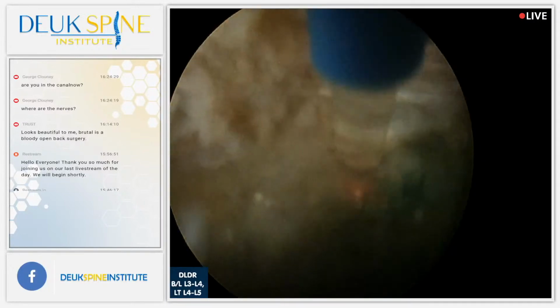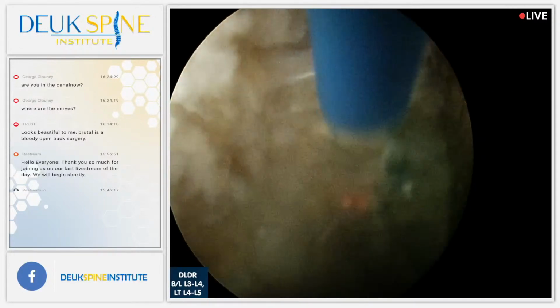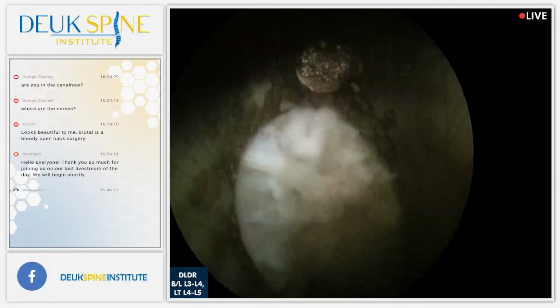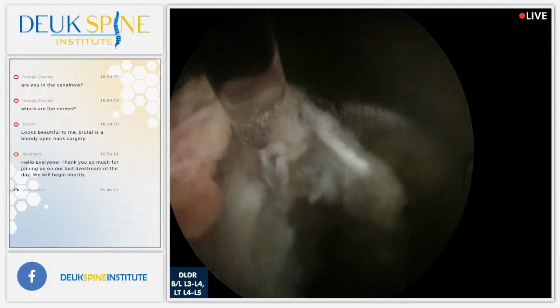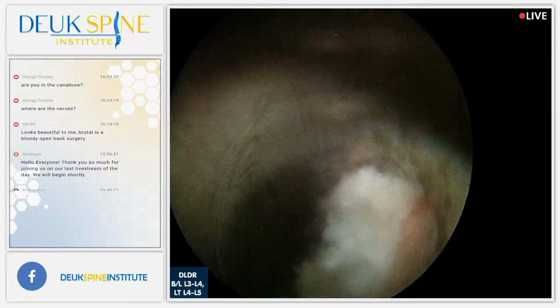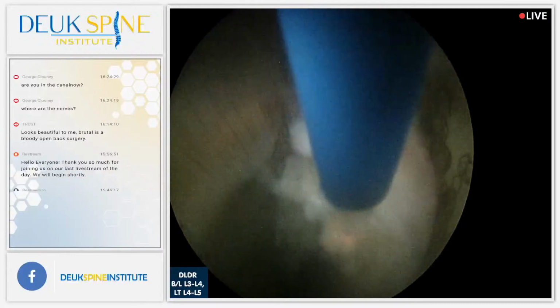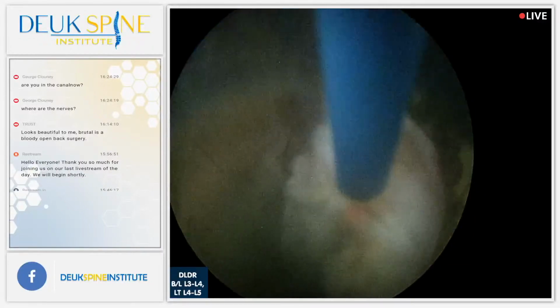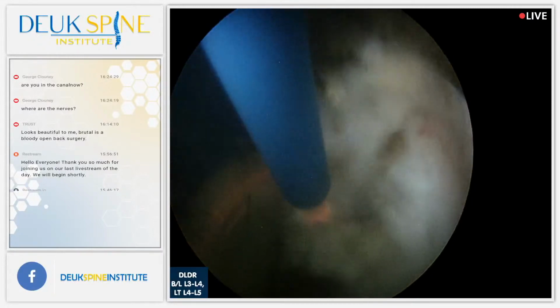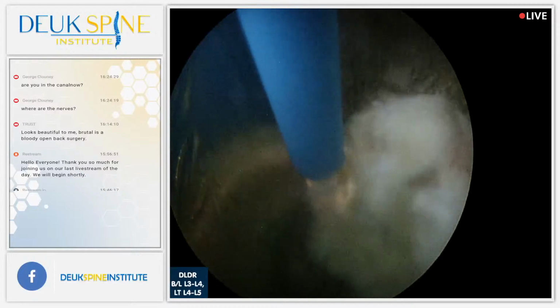Going to feel a lot better. Look how calcified it is. That's not normal. That orange golden stuff is calcium deposits. It's abnormal bone spurs forming. It's all herniation. This is lateral in the foramen.